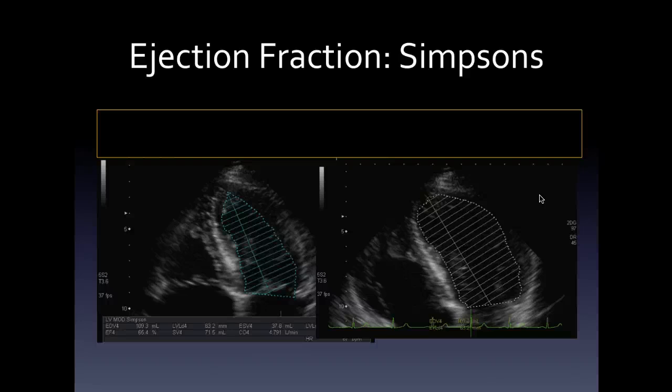And of course, the other thing about it is that because the ultrasound beam is effectively parallel to the lateral wall and the septal wall in this view, it's less accurate for picking up edge definition again as well, because the movement is this way and the ultrasound beam is 90 degrees to it, it's perpendicular to it. So again, it sounds perfect in theory, but in practice these can be very difficult measurements to make.